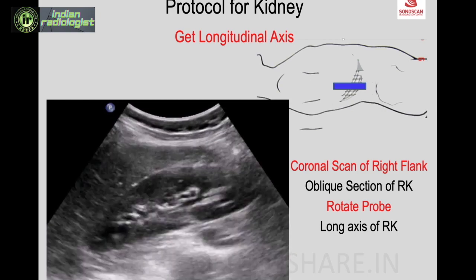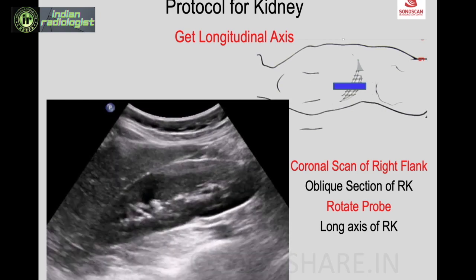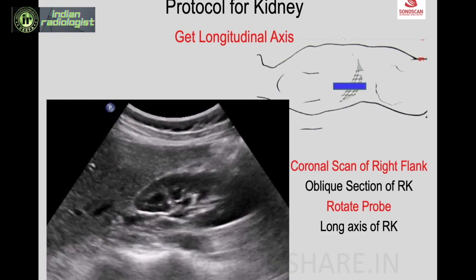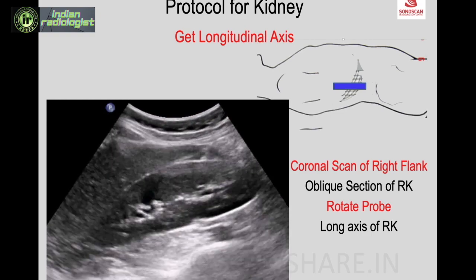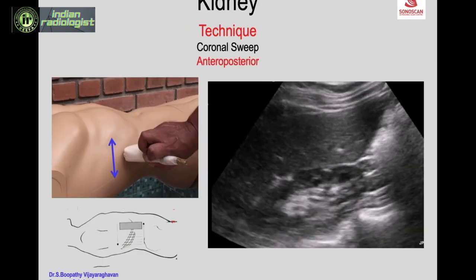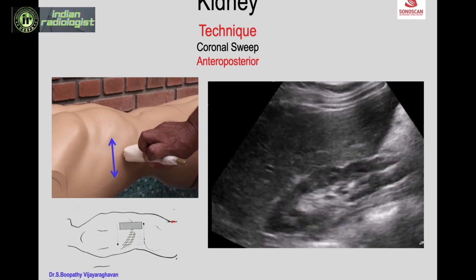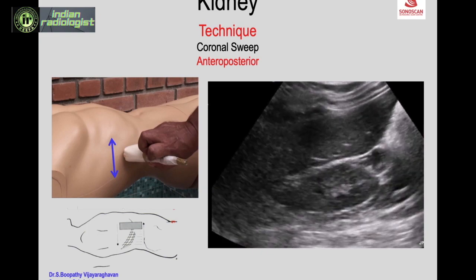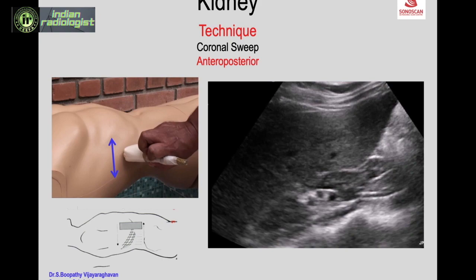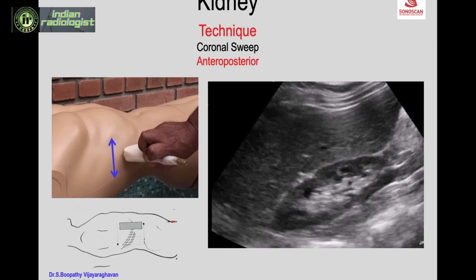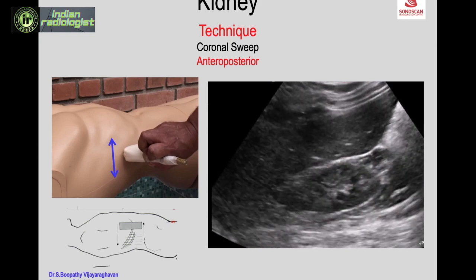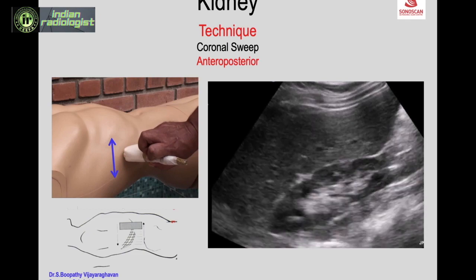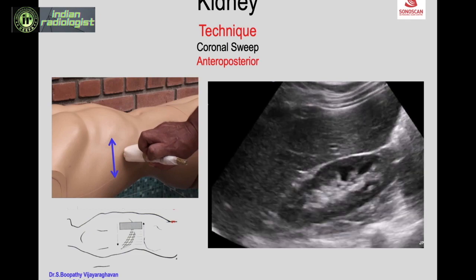If you further rotate it will become oblique again, so get back to the long axis — here it is a coronal scan. Once you get the longest axis in the coronal scan, then move anteriorly and posteriorly to get the sweep of the entire volume of the kidney in the coronal or sagittal scan.